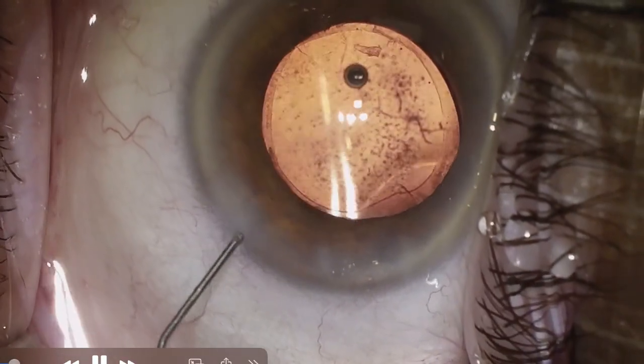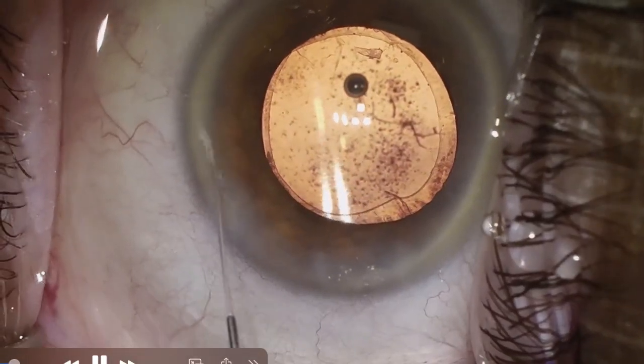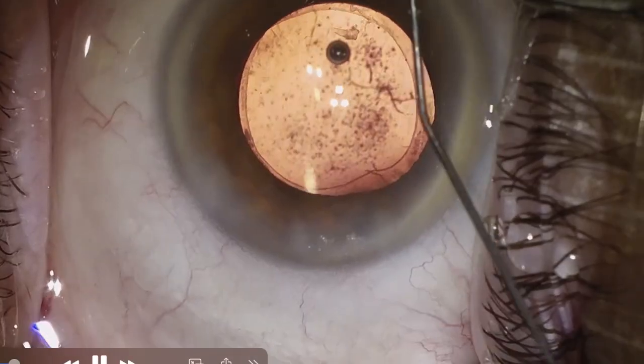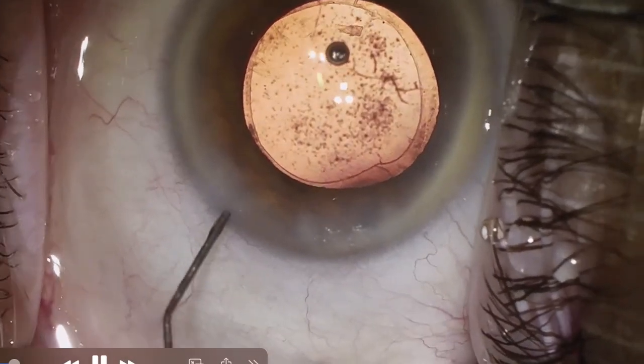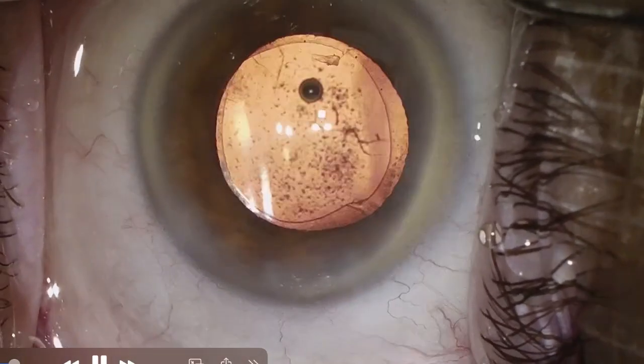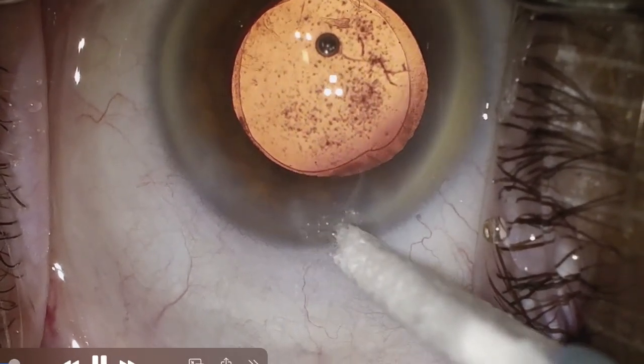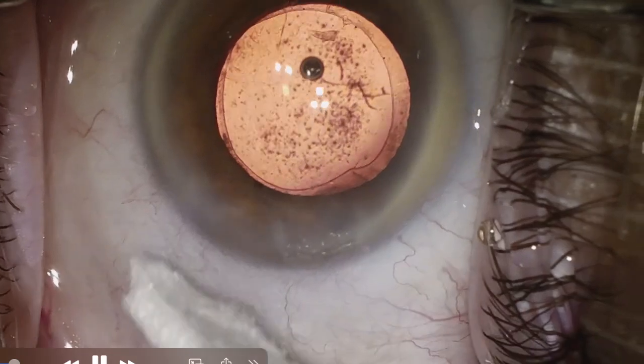Thank you for your attention. When you have corneal dystrophy, be careful. Your view during surgery may not be good, and be prepared for that during surgery. If you need to stay in the anterior capsule, you can. You can stay in it with blue dye if you really have a poor view, and then use your second instrument to protect the posterior capsule. Thank you very much for your attention.